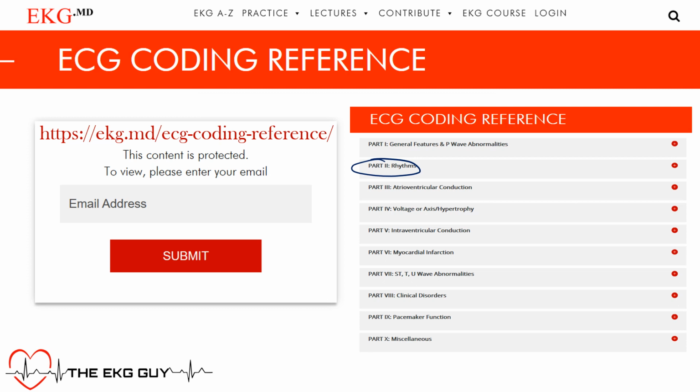We've gone through the general features, the P-wave abnormalities, where we looked at different atrial enlargement, normal EKGs. We went through sinus rhythms in part 2, atrial rhythms, atrial fibrillation, atrial flutter. We discussed Ashman phenomenon. So we've done a number of things. Now we've gone through the AV junctional. Now we're at the ventricular, okay?